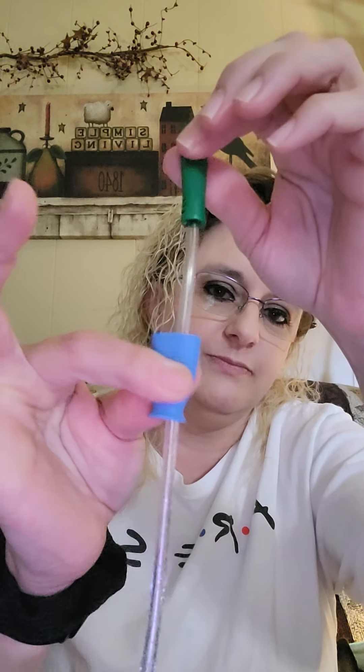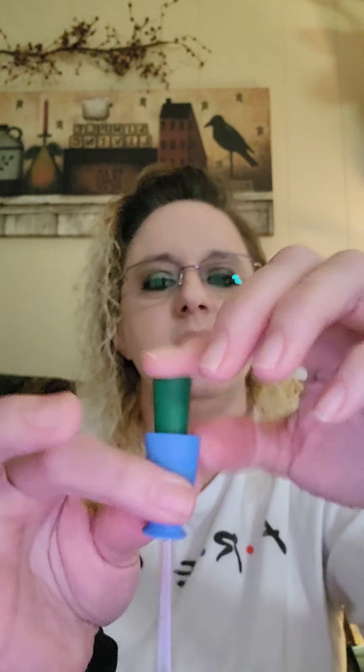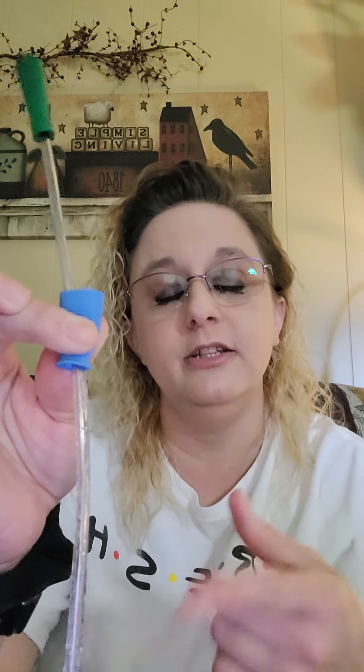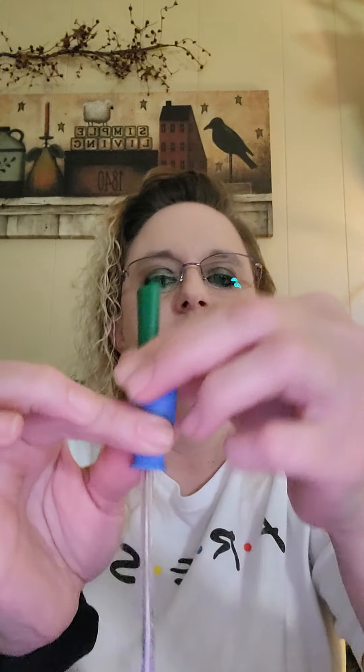A lot of your pre-lubed catheters come with a little grip thing. Some of them are just like a little sleeve; this one's actually a rubbery piece. You use that to hold it instead of touching the catheter, and these pre-lubricated catheters are extremely slick and they're water-based. But this is the funnel end. There's one thing I don't like about this catheter, and it is the funnel end. I'll get to that here in just a little bit.